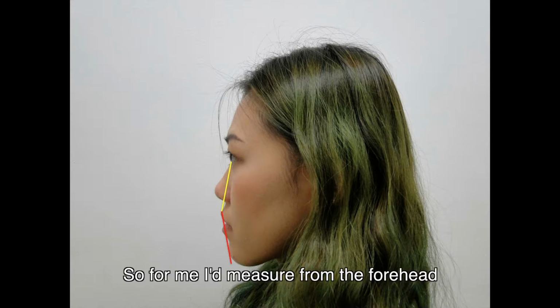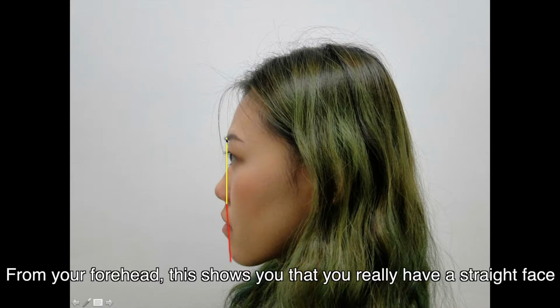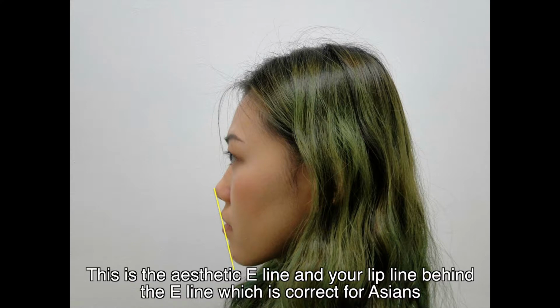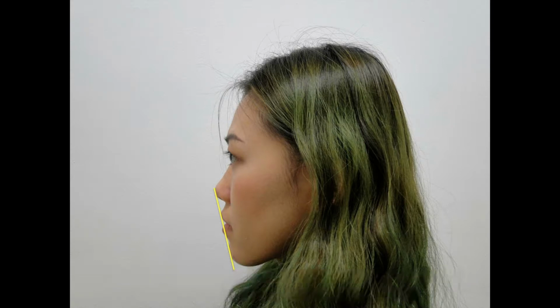So for me, I would measure from the forehead like this. From the forehead, this shows you really do have a straight face. Okay, next. Now this is the aesthetic E line, and your lip line is behind the E line, which is correct for Asian.